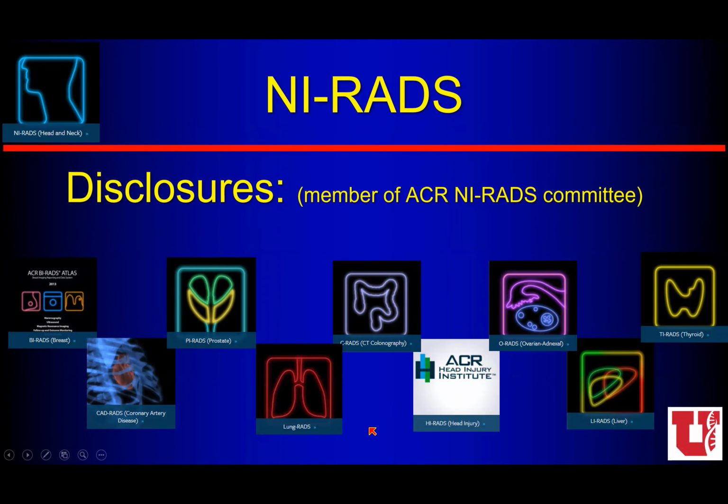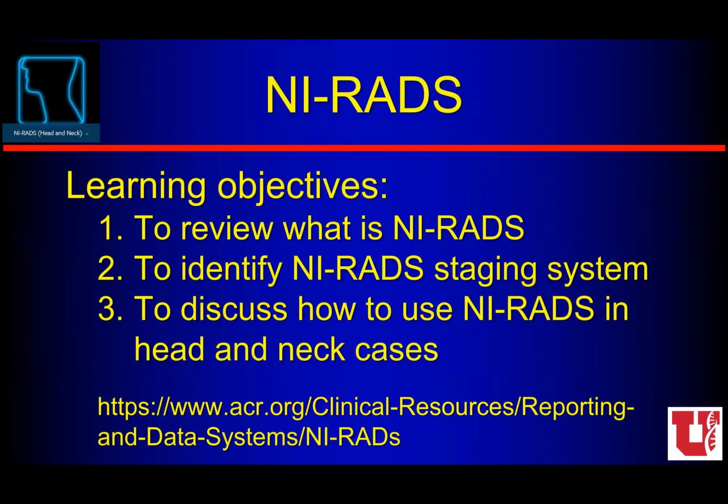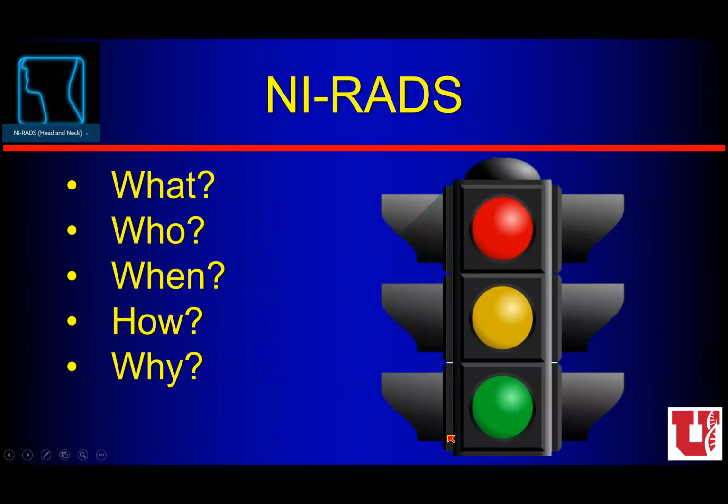I was a member of the ACR NI-RADS committee. I have nothing significant to disclose, but I have spent a lot of time thinking and talking about it, about what the good and bad features are, what I liked and what I didn't like about the NI-RADS system. We'll talk about what NI-RADS is, discuss the staging system, and how to use it. There's a lot of information you can get on the ACR website about all of these reporting and data systems, including NI-RADS.